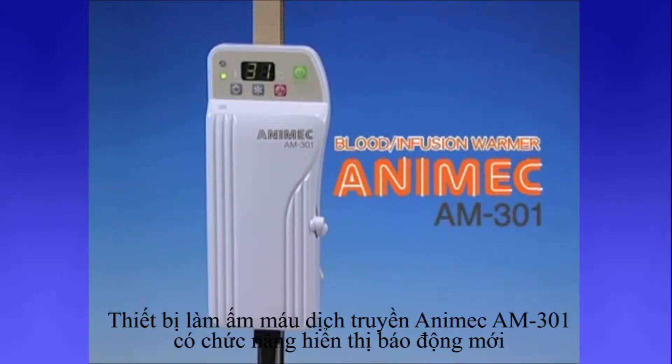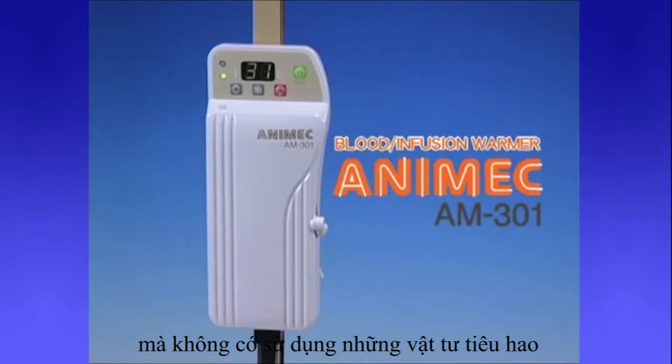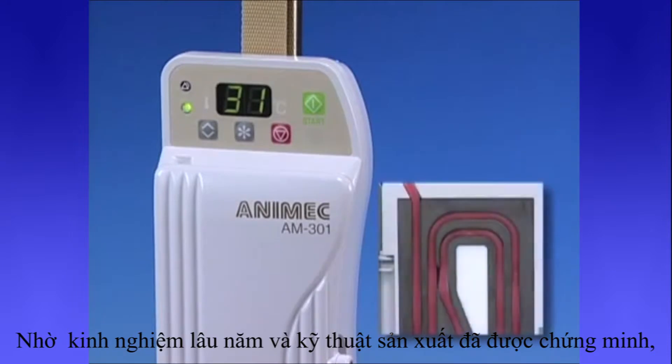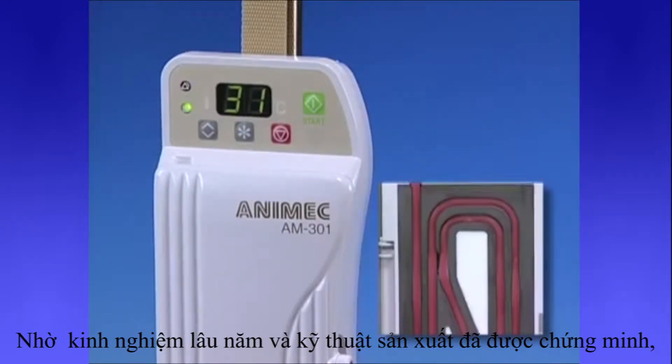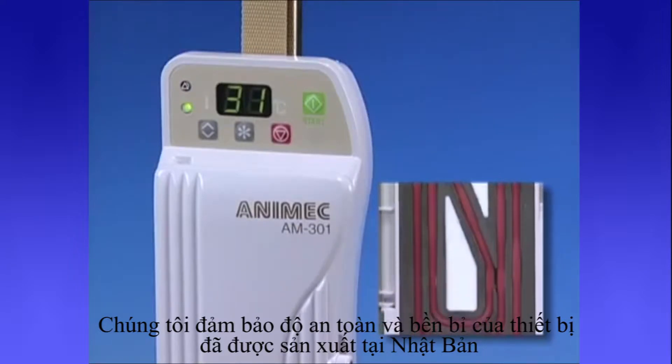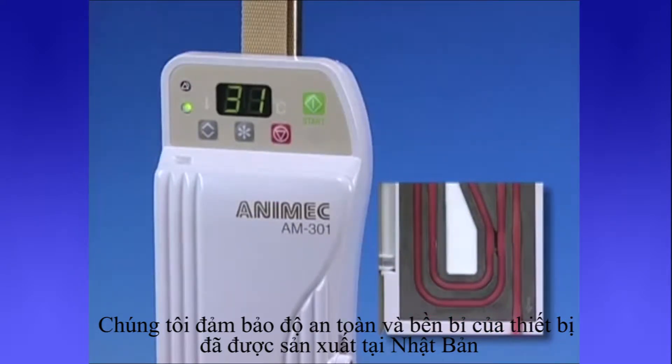The Infusion and Blood Warmer Animec AM301 has a newly equipped display alarm function and does not require a special disposable set. By taking advantage of our extensive experience and proven manufacturing techniques, we stand behind the safety and durability of our product, which has been produced in Japan.